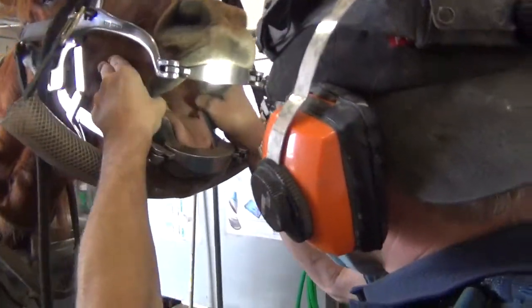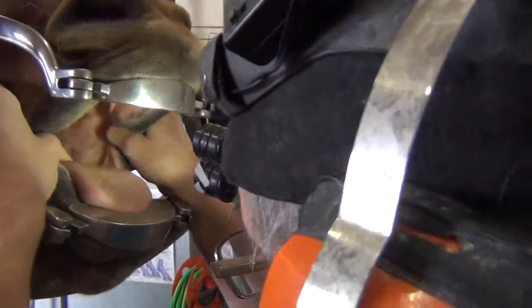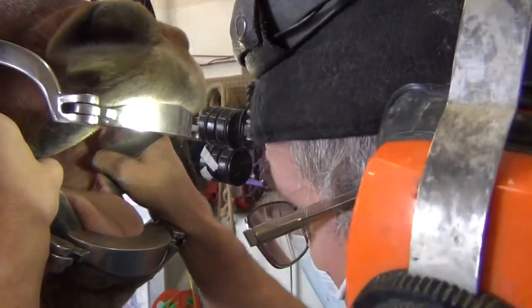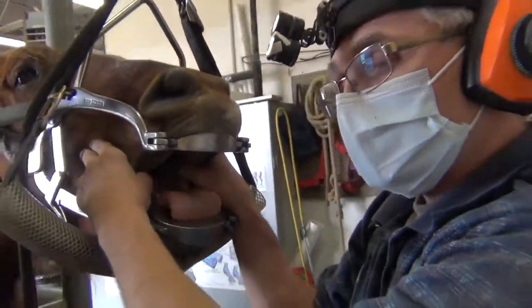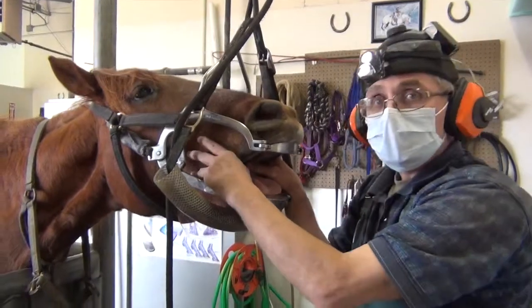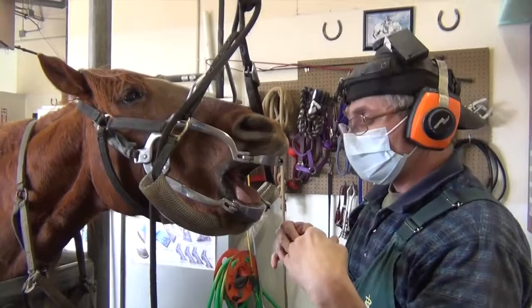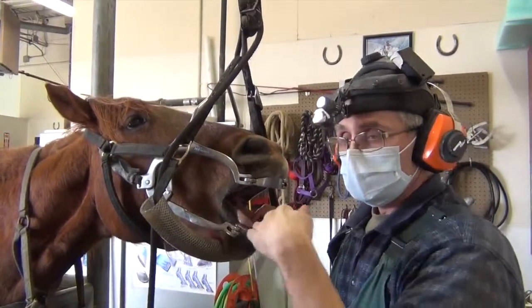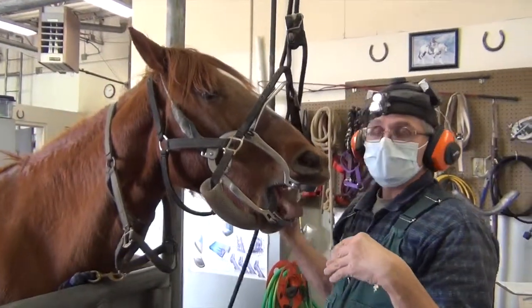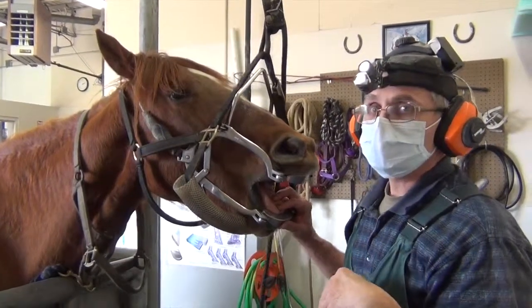So again, when we're doing teeth, we're filing down these sharp rims. We're also going to file down the high areas. But on her, because of her age, I'm not going to make the high teeth as short as the shortest teeth, because that would be too much. And that's where experience comes in doing this, so that you're not doing too much. And it's important for the teeth to be the same height, because then their chewing mechanism works more effectively. And she jumped because I moved my hand too quickly, so sorry about that.